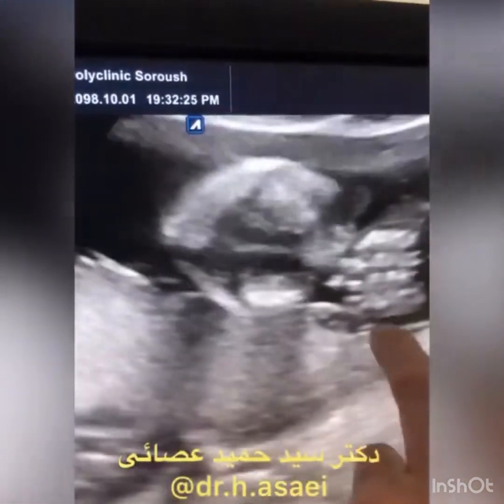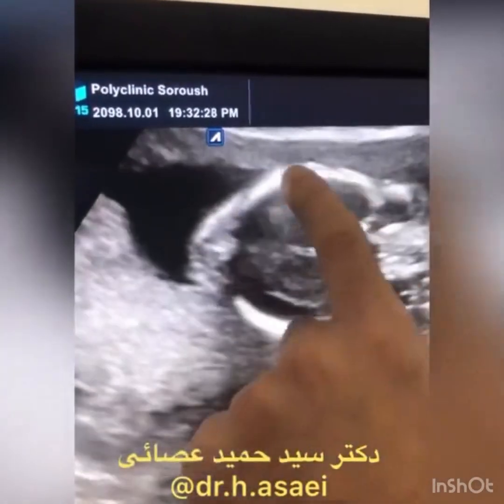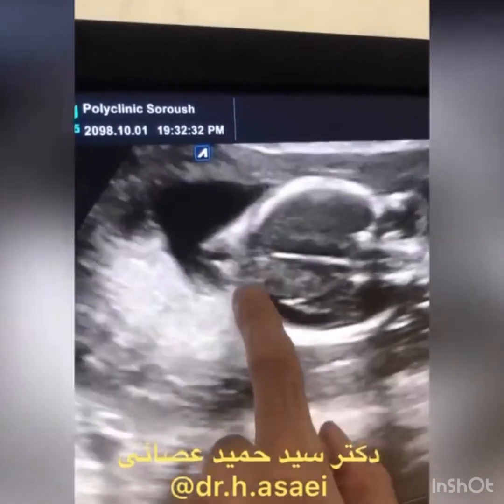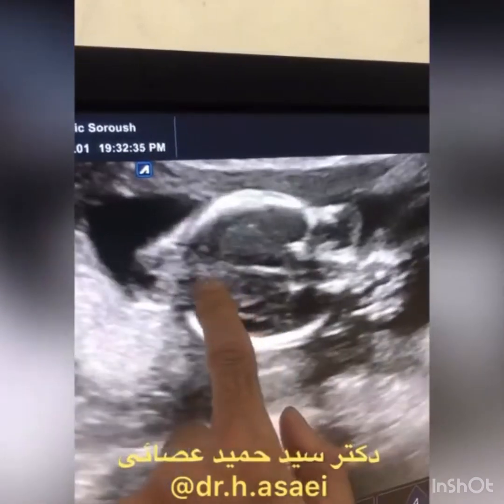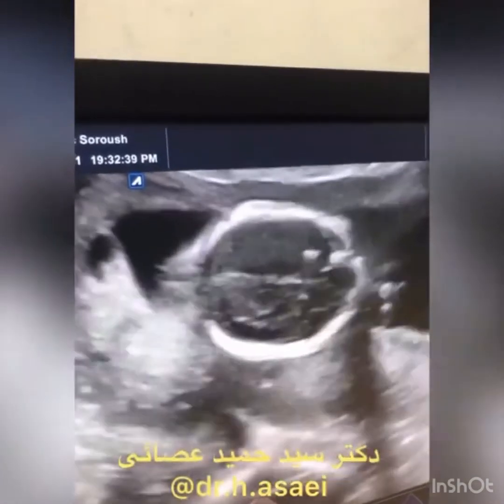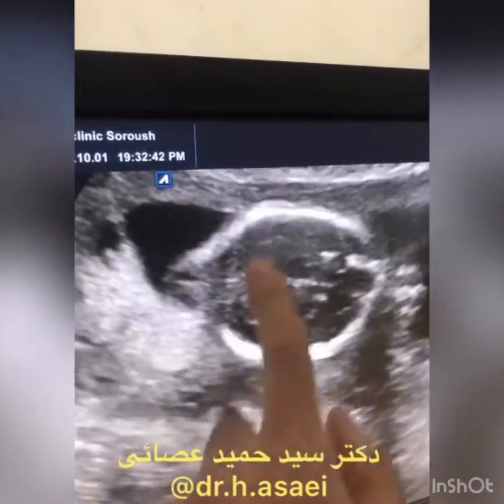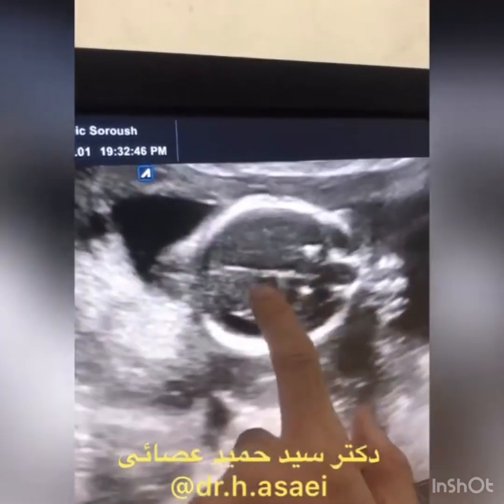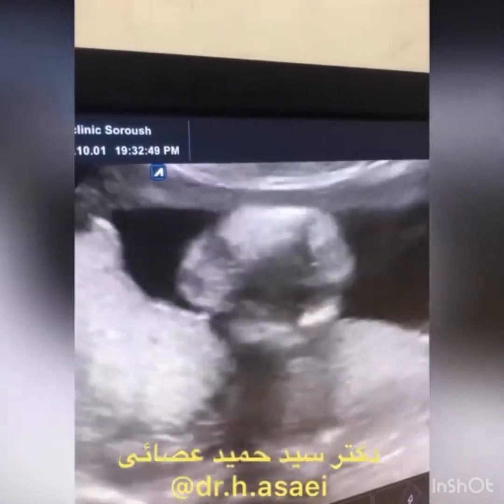This fetus is 18 weeks. We can see both eyes, the calvarium, and brain tissue, but in the posterior part of the calvarium there is a defect through which brain tissue herniates. We can see the defect here — the brain herniates posteriorly.